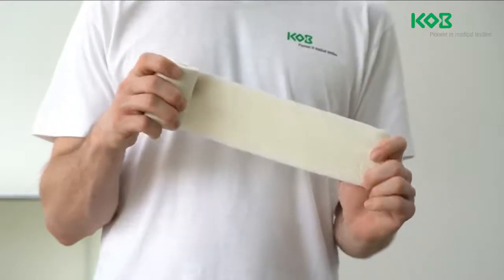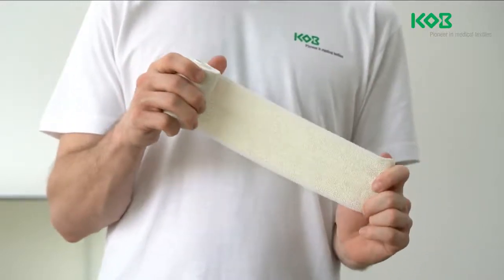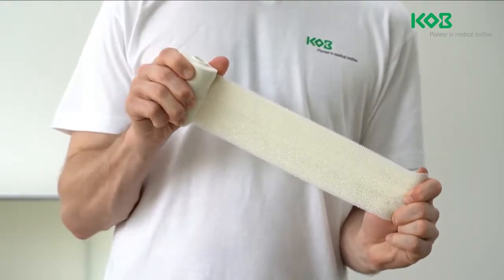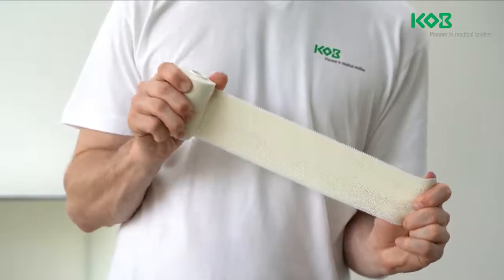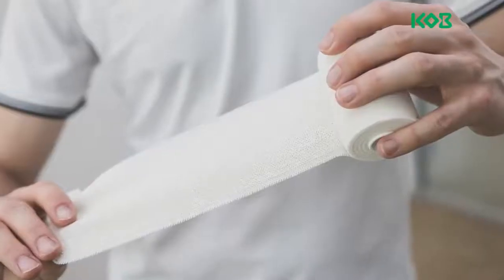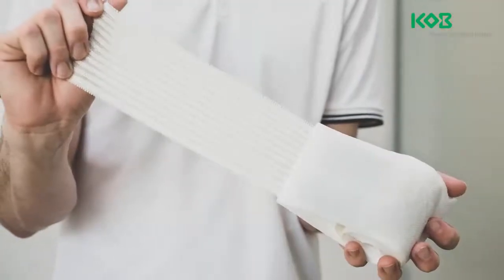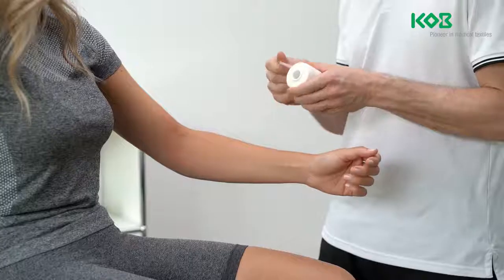The bandage stabilizes the joint while still allowing a range of motion. The uniform pressure created by the dressing can prevent the development of edema and swelling. Bravo Plast is available with a centerline and full coverage adhesive application, as well as a French variant with strip application.